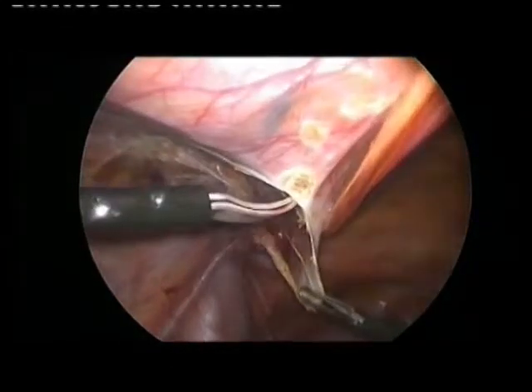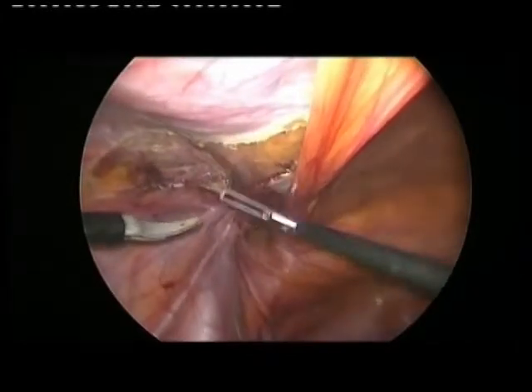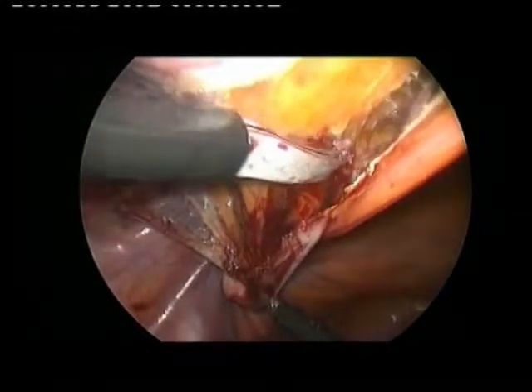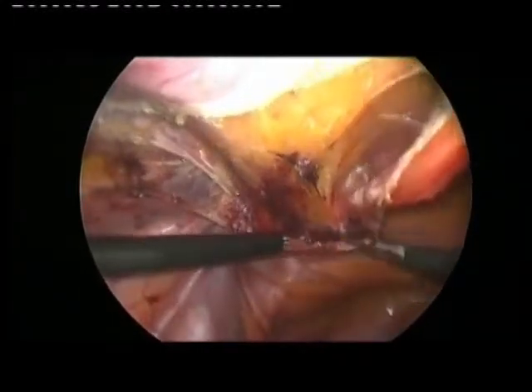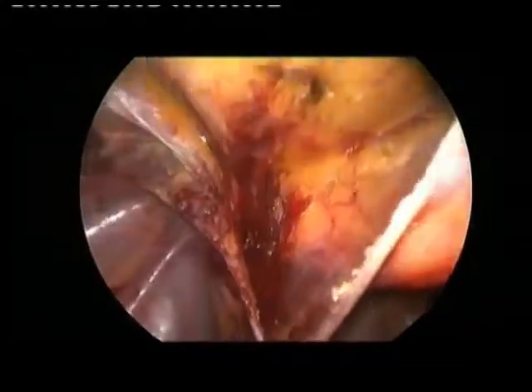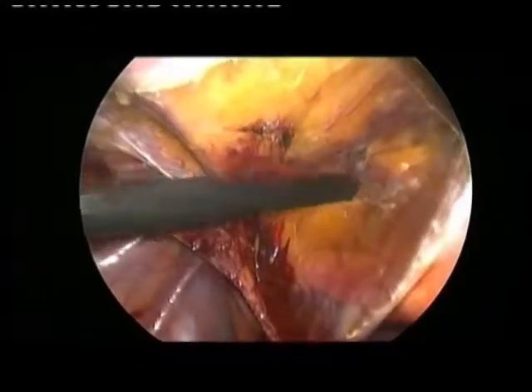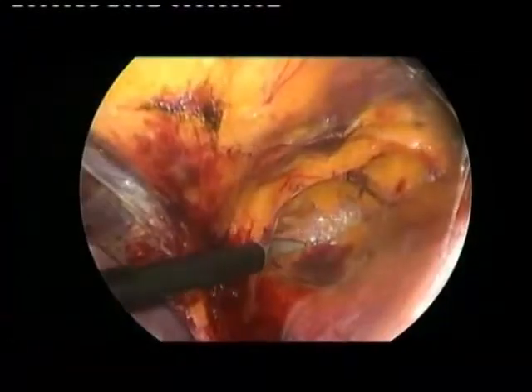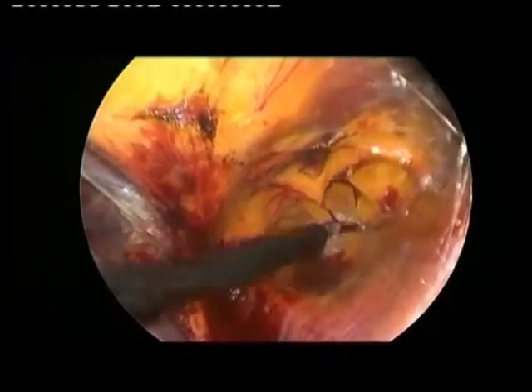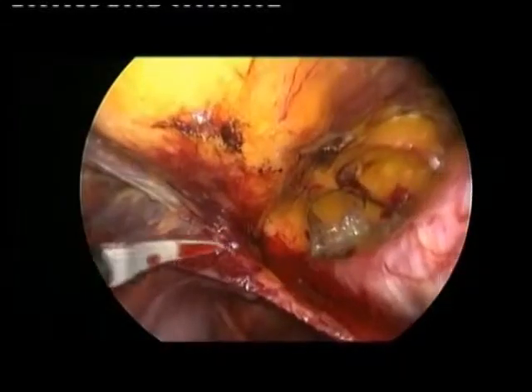Slightly interfering with my position, but it will be okay. The little stent is used only for the first stitches and then it's not useful anymore, because the only place where you can have a stricture is at the beginning of the suture. So with 3 or 4 passages, the last one, and then we tie this suture, this thread.